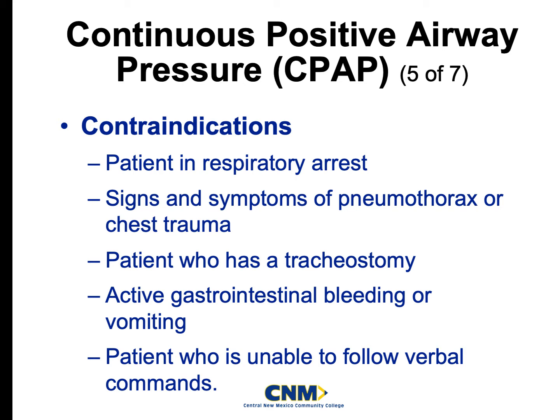And you will actually feel what it can be like. If you put this on your face and hold it tight to your face and breathe in a good 10 breaths, you will feel what it's like to be over-oxygenated. You will possibly start to get dizzy, right? This is a very effective machine at getting good, adequate gas exchange for anybody.